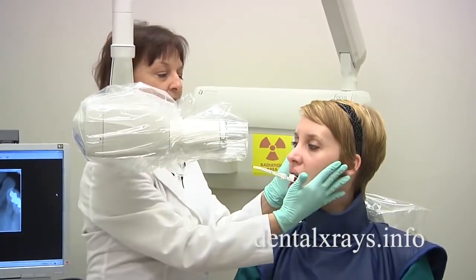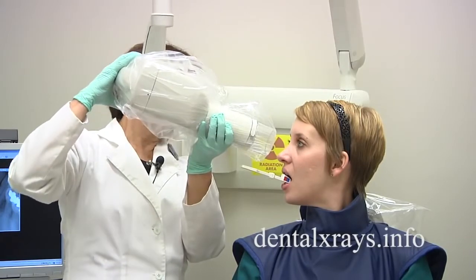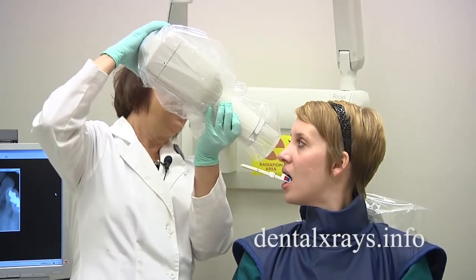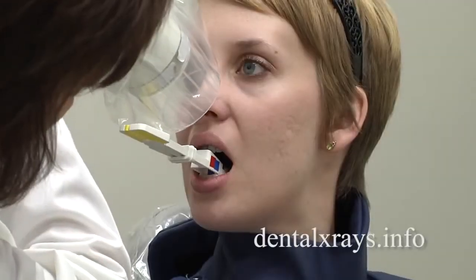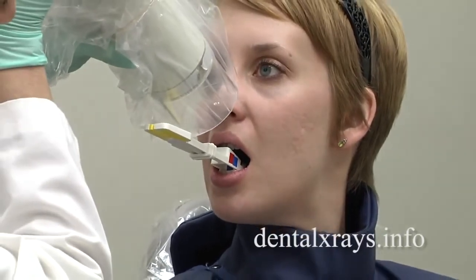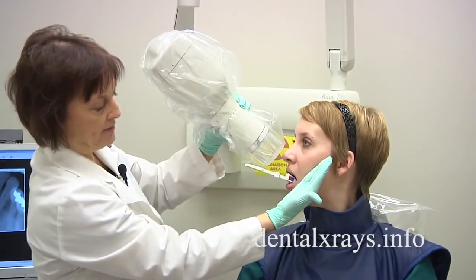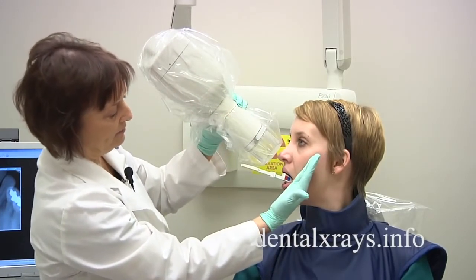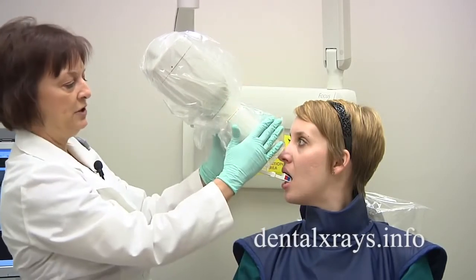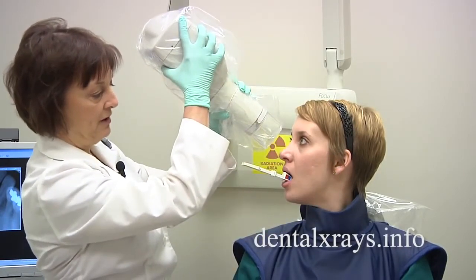Now her anterior front teeth are resting just where you need it. If you look at the direction that this piece is sitting, this is the guide you're going to use to set your vertical tube angle. The direction is slanting at about a 30-degree angle. I'm actually going to start angling this so that the cone continues in the direction that this is flowing — so you can see this would be correct, this would not. What that does is position your vertical tube angle to the position of the film in the mouth, so the x-ray beam is directed almost at a right angle to the film placement. You don't want to cone cut your image — not aligning the circle with where the film is — so you don't want to be too high or too low.